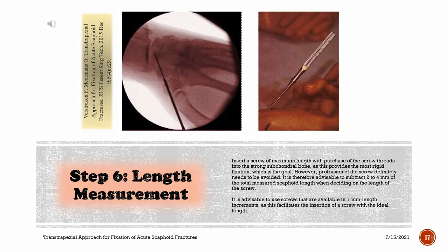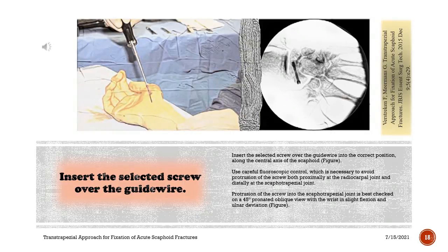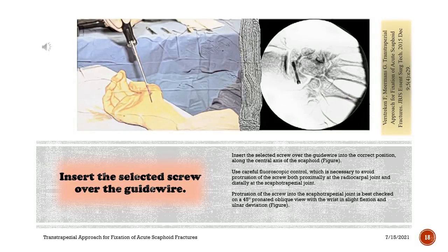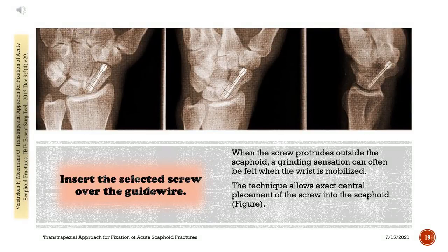However, protrusion of the screw must be avoided. It is advisable to subtract 2–4 mm from the total measured scaphoid length when deciding on screw length. Use screws available in 1 mm length increments to facilitate selection of the ideal length. Insert the selected screw over the guide wire into the correct position along the central axis of the scaphoid. Use careful fluoroscopic control to avoid protrusion both proximally at the radiocarpal joint and distally at the scaphotrapezial joint. Protrusion at the scaphotrapezial joint is best checked on a 45-degree pronated oblique view with the wrist in slight flexion and ulnar deviation. When the screw protrudes outside the scaphoid, a grinding sensation can often be felt when the wrist is mobilized.